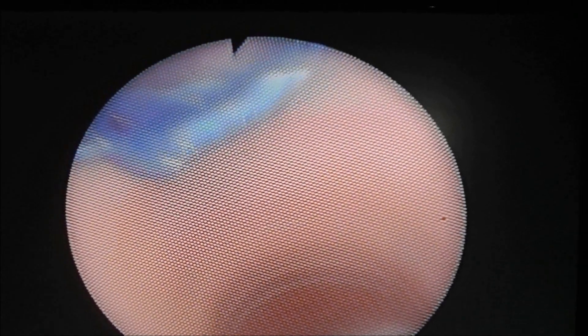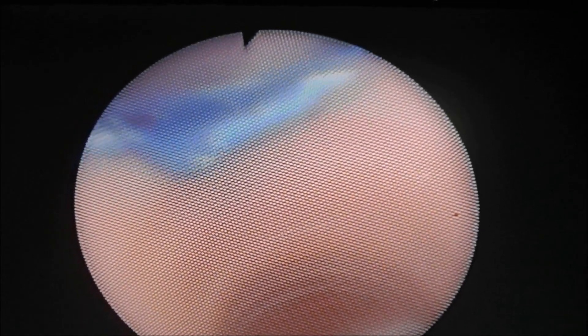Once the tube is advanced, I'm going to back out of the bronchial lumen and go down the tracheal lumen. Going down the tracheal lumen, I will see that the bronchial cuff is off to the left and that it is not herniating over the carina.